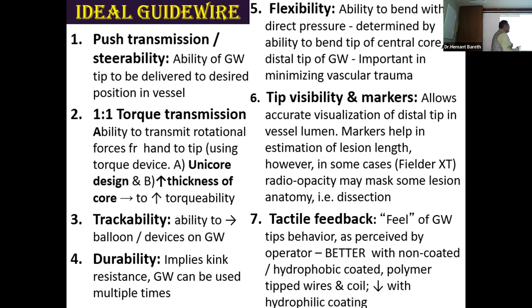And then there is something called tactile feedback. In PCI, you are dependent on your eyes for everything. So your vision is being used for PCI. But for good PCI operators, there is also something called touch sensation, how the tip is behaving, if you can experience that feel. If you push, then you feel the resistance. If it goes simply, you feel that it is sliding through. That feeling of the tip is called tactile feedback. Some wires, particularly non-coated wires, have the best tactile feel.